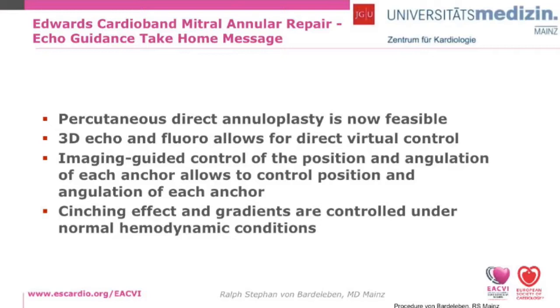As you may have seen, we normally only employ transesophageal views, with very little change between transgastric and transesophageal views if you use 3-dimensional echo. The main concern here is patients with portal hypertension, patients that have varicosis of the lower esophagus, or where you pull and push the probe in a banded situation.